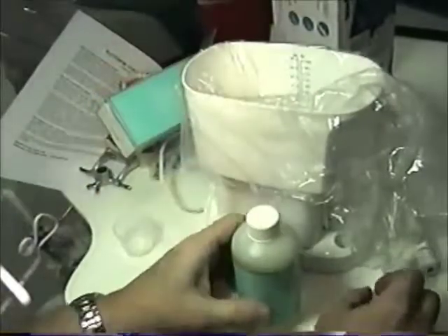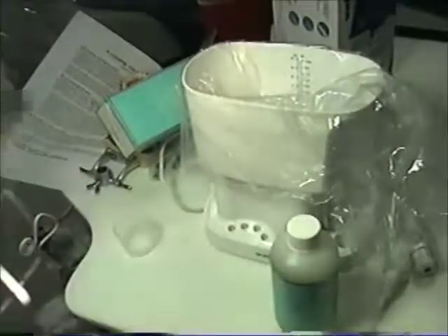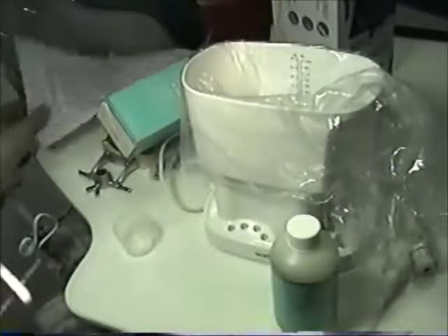So if you're water picking, you need to water pick every night. There's actually a form that we give you when you buy the Waterpik, and it says you will have to do this until Dr. Fox approves of the color of your gums. Do not stop until you get with Dr. Fox on this. It says it's done every night, and it can be done in the morning and after dinner, twice a day. But once your gums get better, you ask Dr. Fox, hey, can I stop doing this every night?